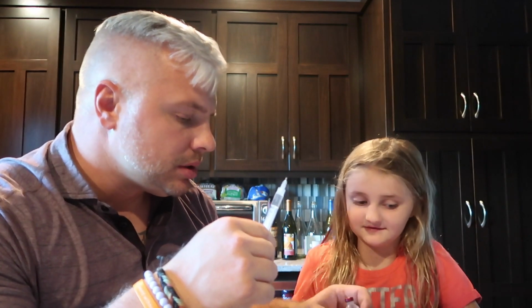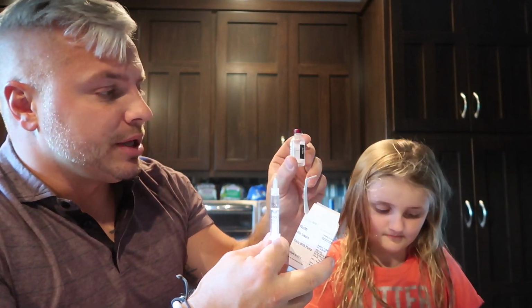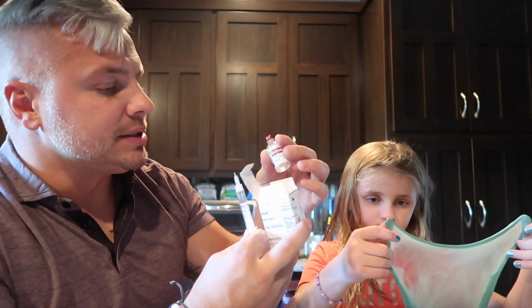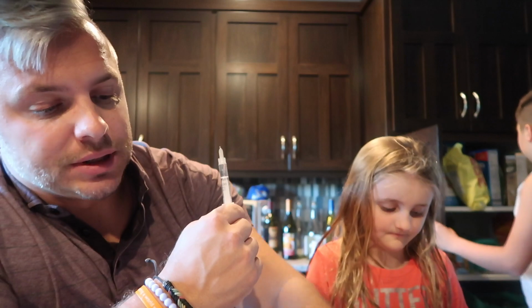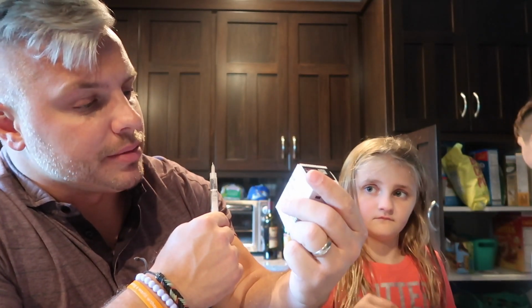I don't know. Somebody opened this out of turn, which means I don't know how long it's been in here. It's already like a third gone. So that means we might try it the next time, but if it doesn't seem to be effective, we might have to switch to the Novolog earlier than we thought, because once you actually open this, you guys know, or if you don't know, once it's opened, you have 30 days to use it up. I don't know how long this has been open, so this already might be bad. I don't think we should use it. Expiration date isn't bad, but once you open it.